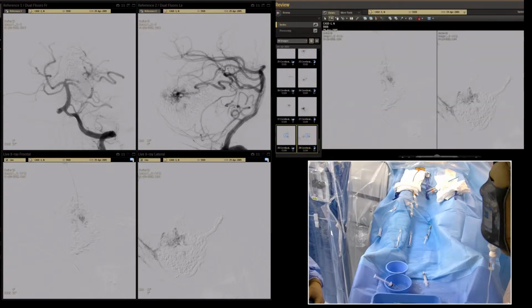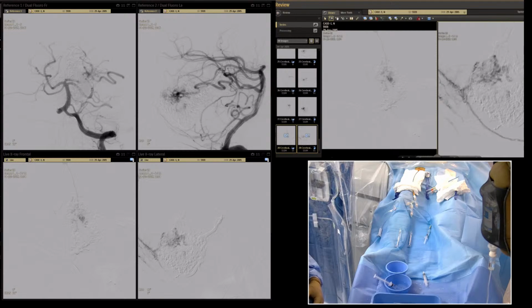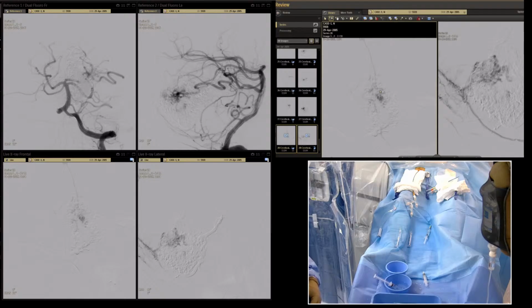We'll start from here. It's very important. These branches are going to the brainstem, and we don't need to go there. We need to stop at this point. It's a 35, that's why it should be okay. And there is some dural supply, but it's not a problem. We can exclude all this region.